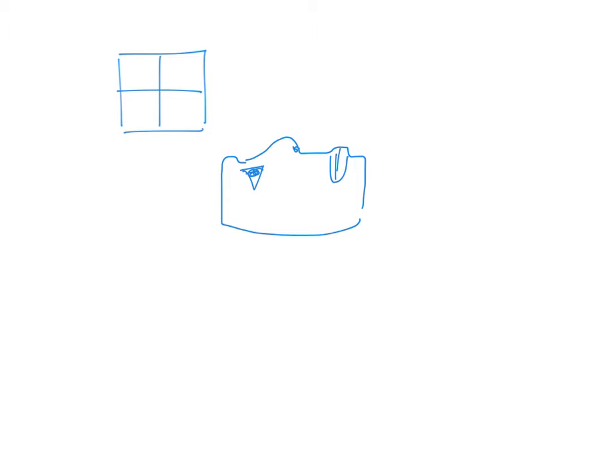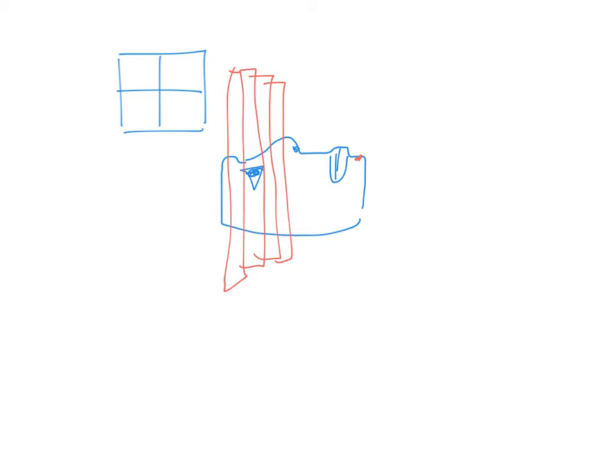Okay, so to get the 3D image of the human head, what they will do is they will scan around this slice. So they will get the image of this slice. Oh, there's a mole also. They will get the image of one slice, and then the next slice, then the next slice, and then they build it up into a 3D image. Because if I can get the slices like this and combine them, then you will be able to rotate this image 360 degrees, either top and bottom, left and right. Then you get a 3D image.